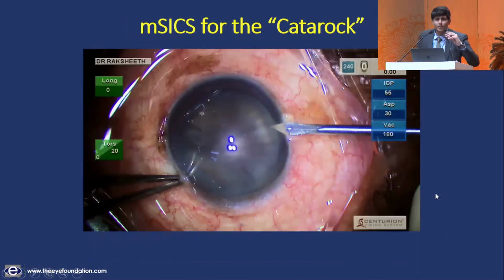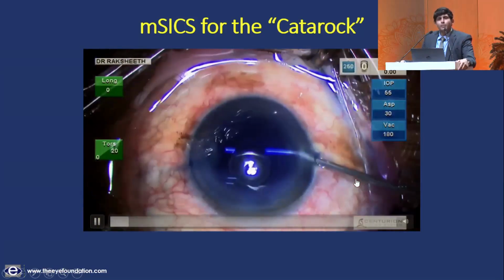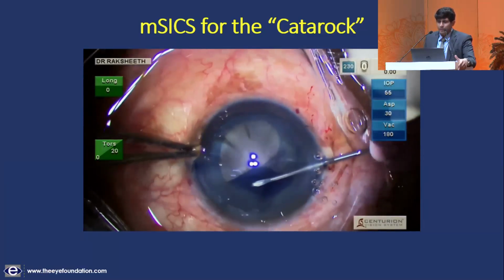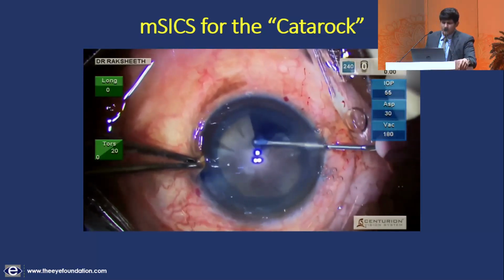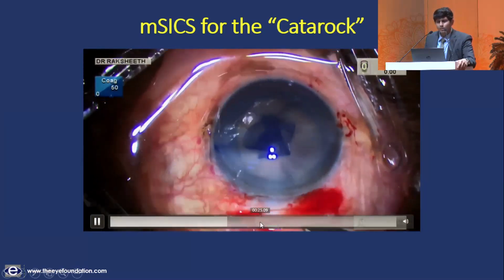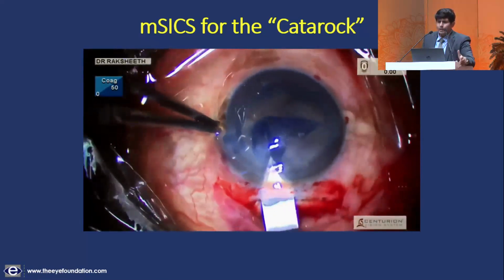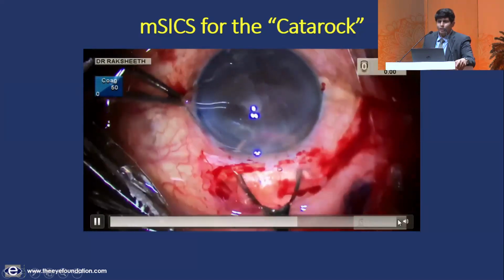So in certain situations, we don't ask the question, can phacoemulsification be performed in this case, but rather, should phacoemulsification be performed. In this sort of a black cataract, the chances of having intraoperative zonulopathy and propagating the damage iatrogenically is a lot higher. And it's possibly better in these cases to proceed with a large rhexis manual small incision cataract surgery. One can go ahead and create a 7mm plus capsular rhexis and wheel this black nucleus out of the bag and into the anterior chamber quite atraumatically and quickly.